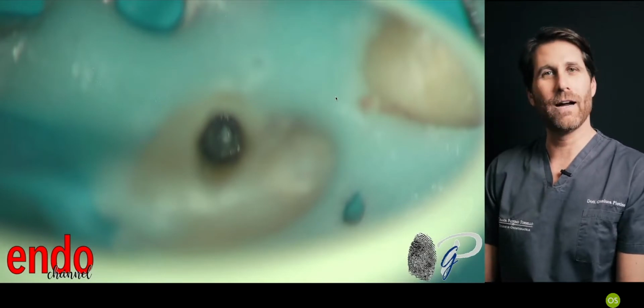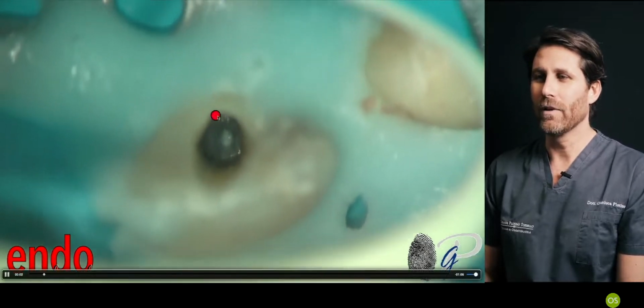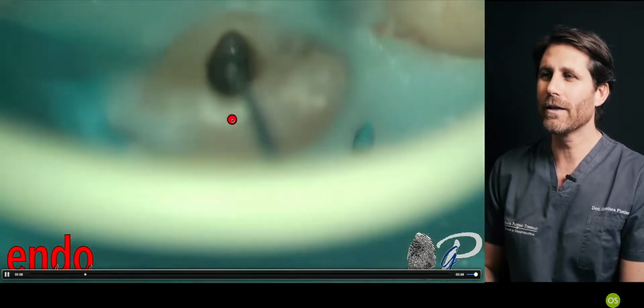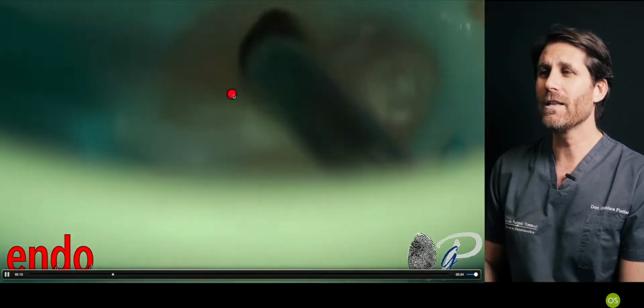As soon as we have accessed the root canal and we have cleaned the internal resorption, the difficulty in this case was to find the very small dot where the canal was under there, because there was a very big space created by the internal resorption.